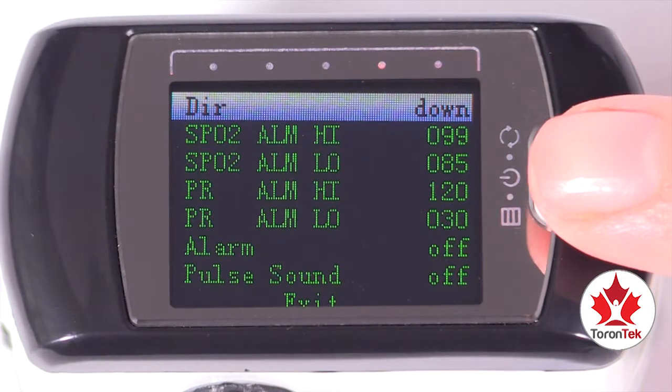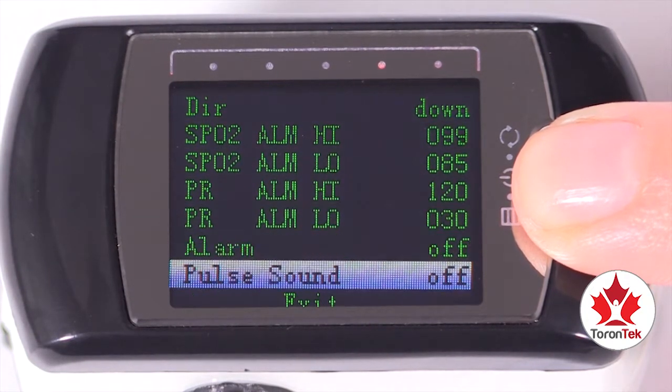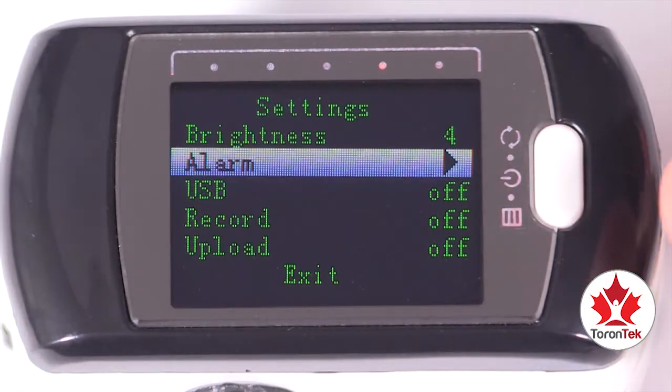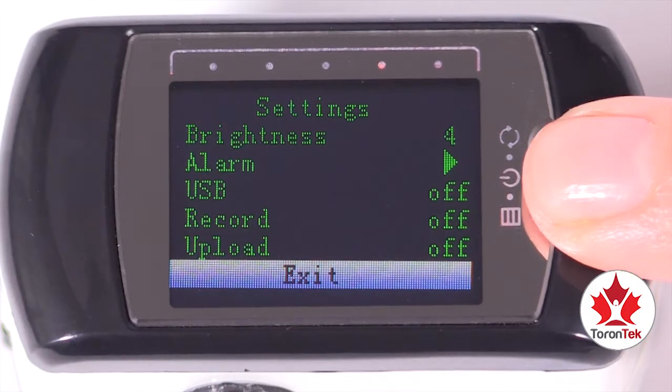To exit a specific setting screen, scroll down to the exit option with exit highlighted, then press the menu button for two seconds. Repeat this step if you want to exit the menu screen completely.